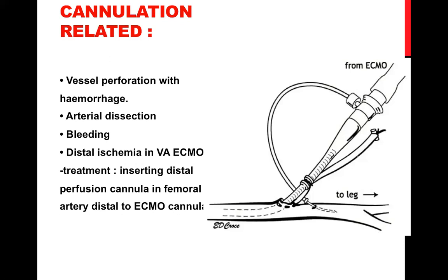For example, if the patient is coagulopathic, maybe we will go towards central and keep the chest open. And also the argument for closing the chest and keeping central is less infection and less bleeding in case of bleeding. Which approach do you prefer, or do you just go peripherally and close the chest?